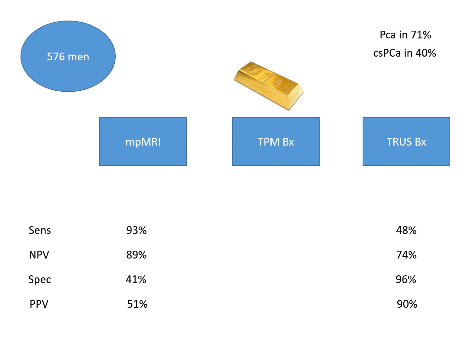That's not what we're trying to do with the MRI. The point is that if you do the MRI, then you should biopsy. But what we want is for the MRI to give you the confidence that if it is normal, there's nothing significant here and we can be reassured. That's where the power of the MRI comes in, and that's what the study shows quite nicely.